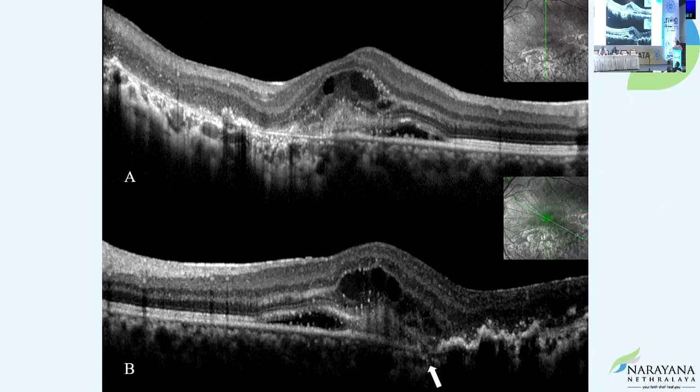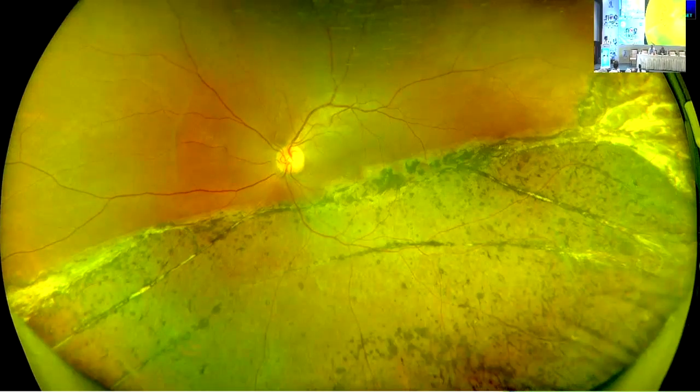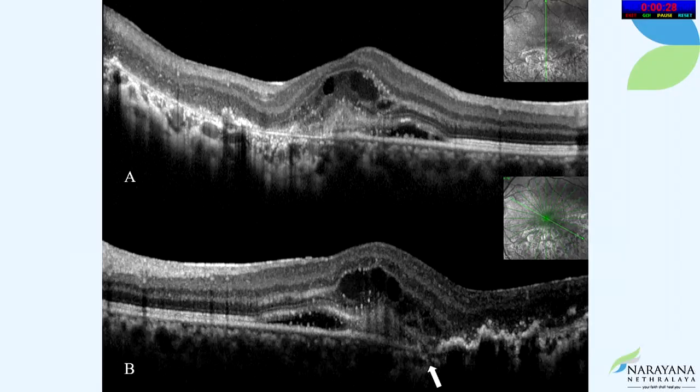How the pathogenesis of that, it does not look like a scar. A post-inflammatory CNVM is also different, they behave differently. There was no inflammation at all. Yeah. If you go back to the color photograph, it is at a junction of the normal and the detached retina. Exactly there. So can it be just because the RPE atrophy is lying in that area? So probably the Bruch's membrane is weakest at that area. So this is the junction of the normal Bruch's membrane and the weak Bruch's membrane. So whatever has started popping up through that area, probably that's what I've shown with the arrow as well. That's the junction. That's the logic.